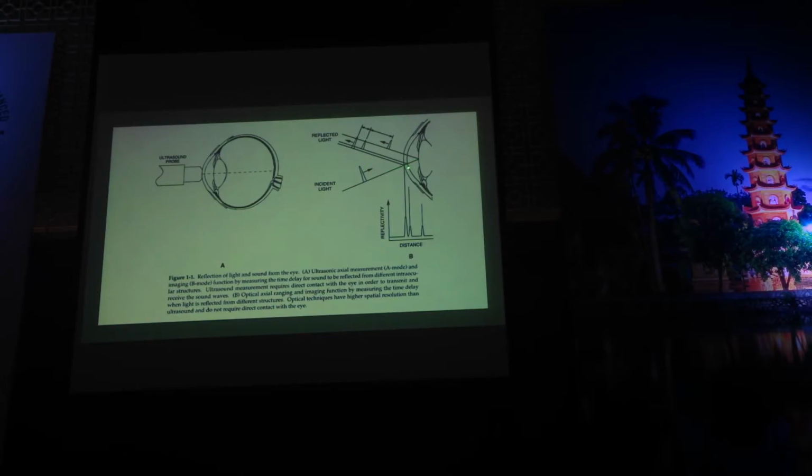When the light passes through various structures of the eye, like the anterior surface of the cornea or the posterior surface of the cornea, there's a little bit of time delay, right? Because it's scattered back differently when it passes different tissues, different structures of the eye. So it produces different time delays of the reflected light. It's not only the time, but also the magnitude that I mentioned earlier. The magnitude is different as well.